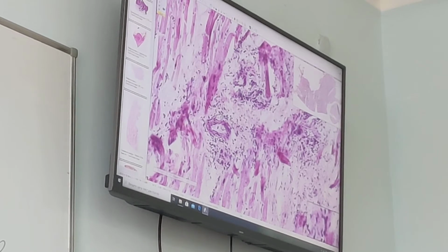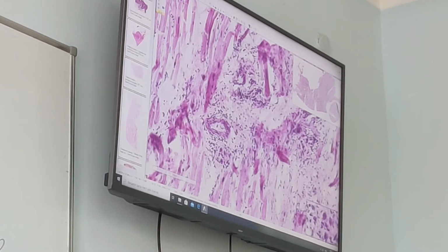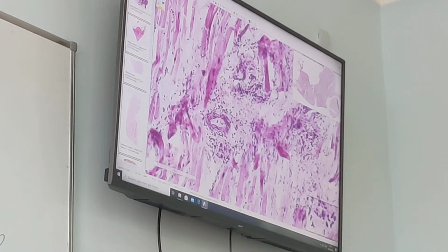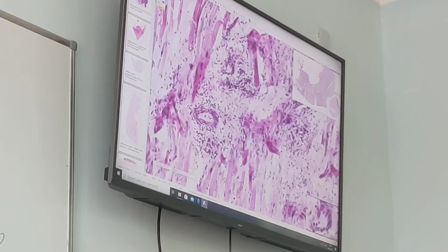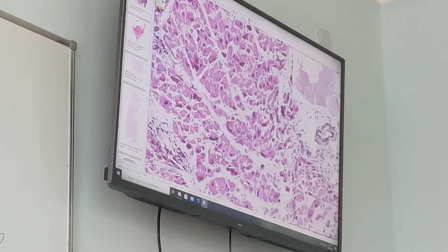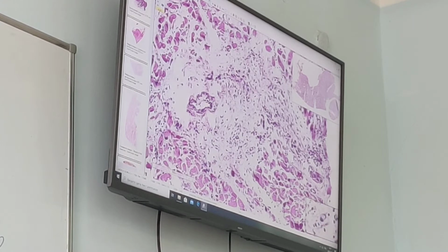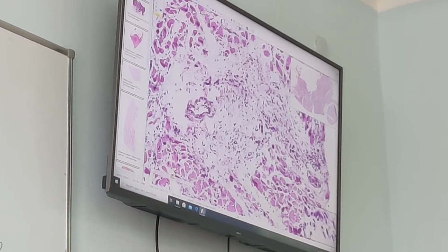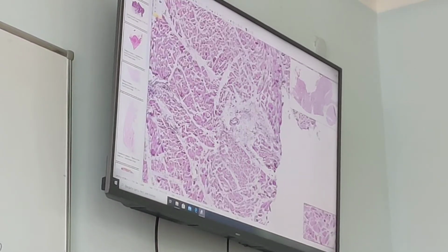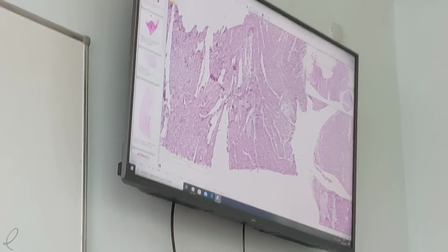One more time, lymphocytes, plasma cells, macrophages, giant multinucleated Aschoff cells. Anitschkow cells cannot be clearly determined because they are small. Fibrinoid necrosis and multiple inflammatory cells. These are blood vessels, one and second. And also last stage of development of granuloma, this is scarring. We can see again blood vessels and around it clear area of connective tissue growth. Some spots, these are foci of inflammatory cells. So rheumatic granulomas in myocardium. In this area you can detect a lot of different granulomas.